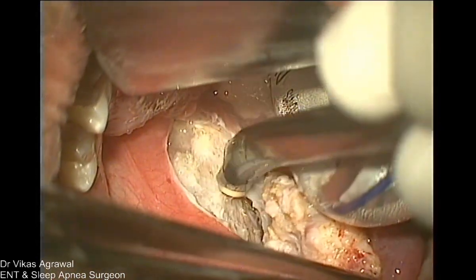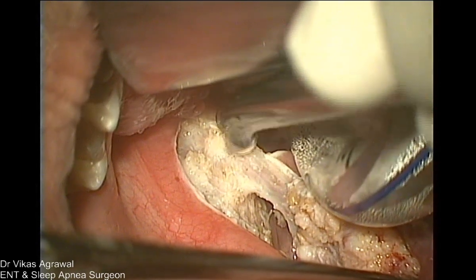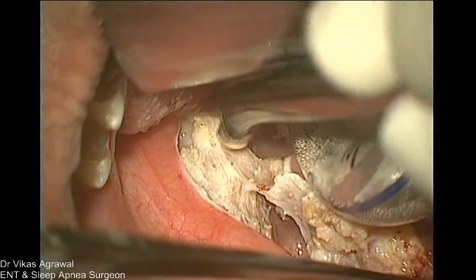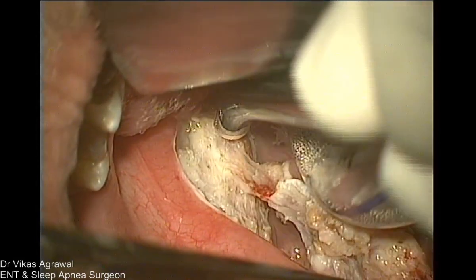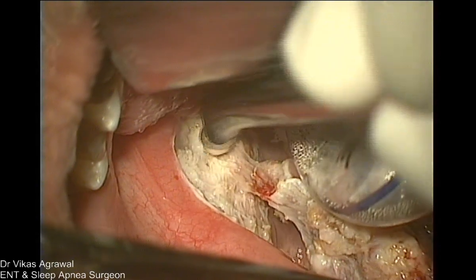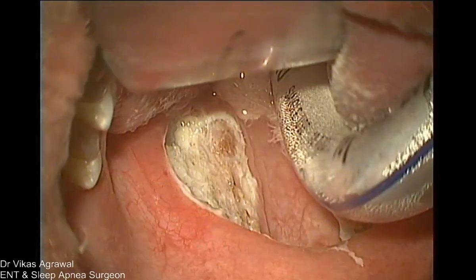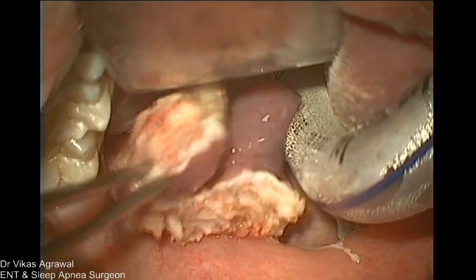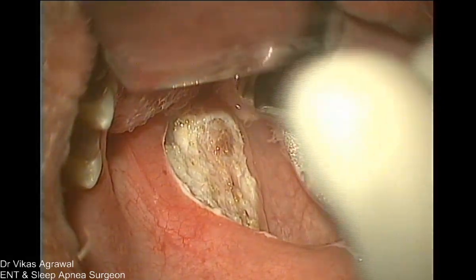Okay, so this is the vertical fiber, this is the oblique fiber. Are the heads very, very clear? Yeah, absolutely. Seen very well. So now I am dividing it from here, and can you see that small thing? Sometimes this vessel is really big. So you have to coagulate that not only at the tip but also from the back. And that's the palatopharyngoplasty over. You see how much tissue was removed from here, right? So this tissue which was collapsing has already been removed.